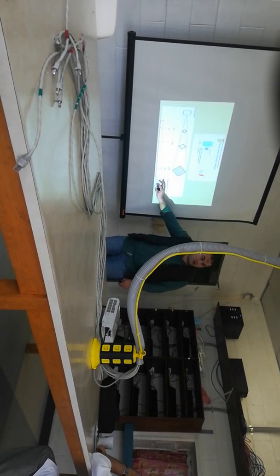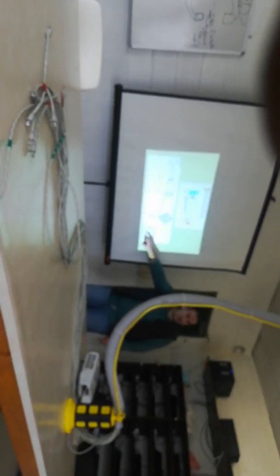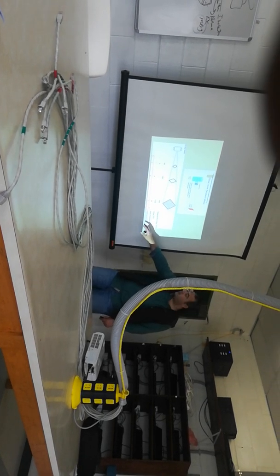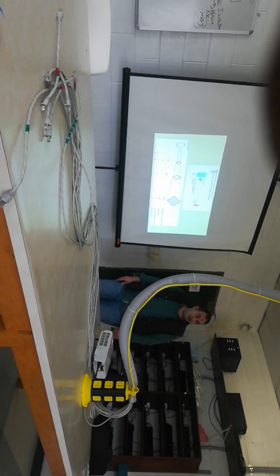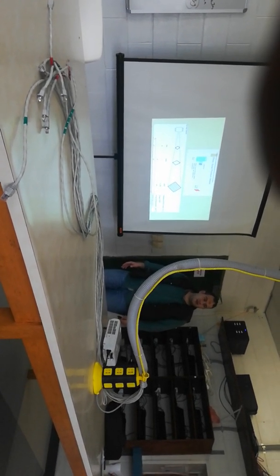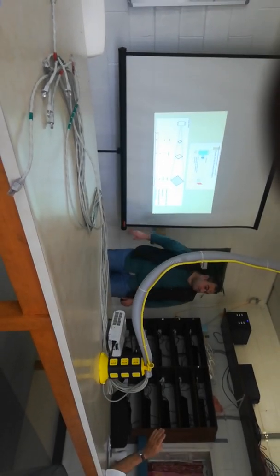Here you find the dose. Here you will find the area of exposure. The area is increased: 1 becomes 4, becomes 16. Here the dose area product will be the same. Why? Same number of photons.